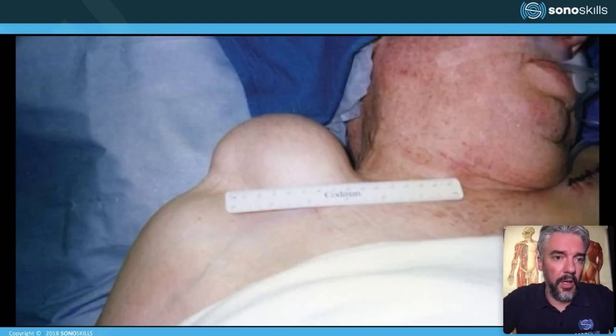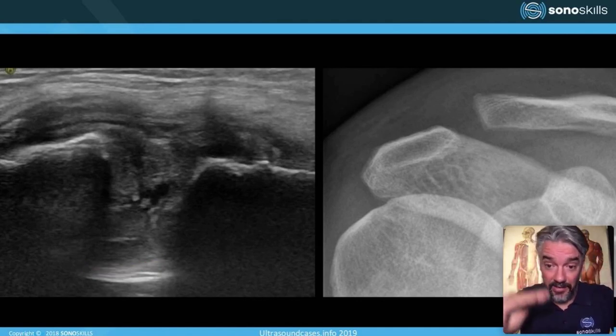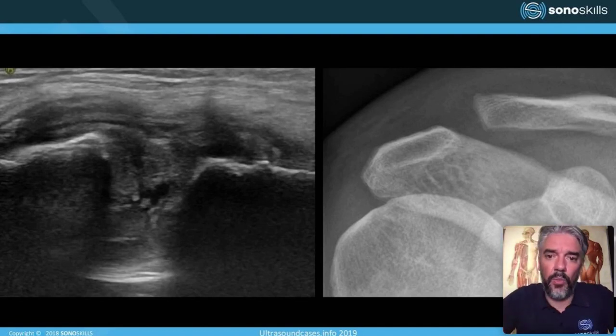This is a clavicular resection. The AC joint has been resected, and this allows us to beautifully see the capsule in the depth. So you know that this capsule is indeed in the depth when looking in quite an open AC joint. Well, this is a lot open because of the resection.